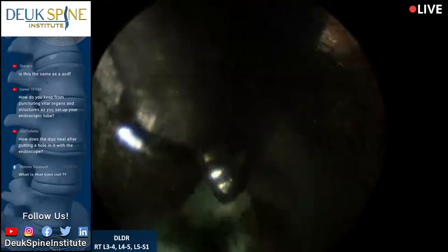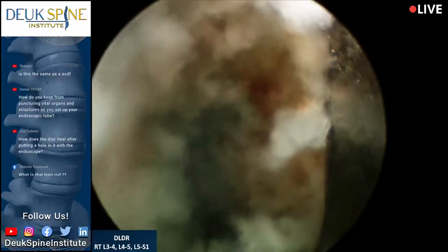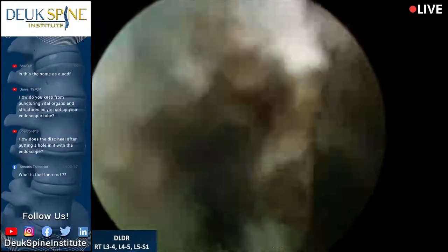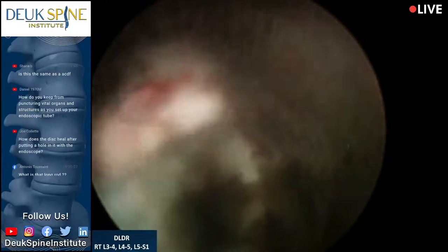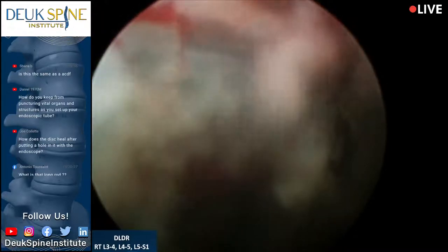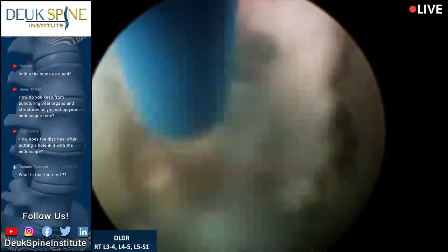Endoscopic surgeries typically use a lot of liquids, irrigation. So it's common to have water on the floor, but we want to try to find ways to minimize the amount of water as it poses a hazard, of course, to the staff slipping and falling or even getting electrocuted. Our operating room here was designed with a special circuit that prevents anyone from getting electrocuted because there are endoscopic procedures.